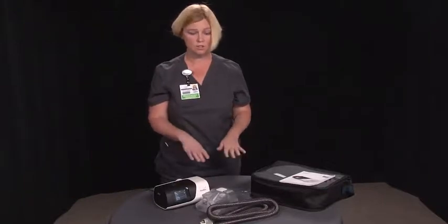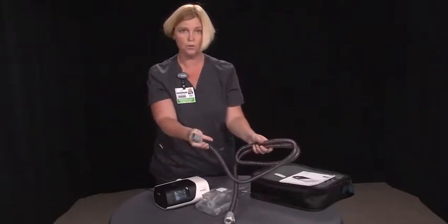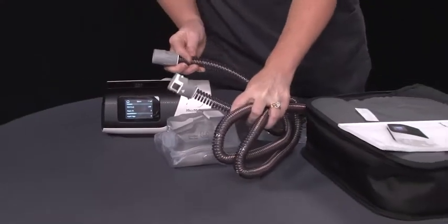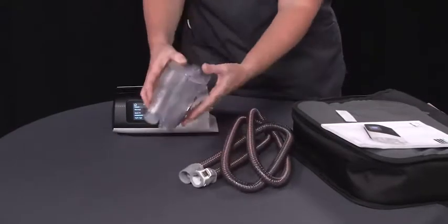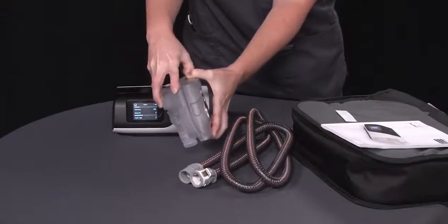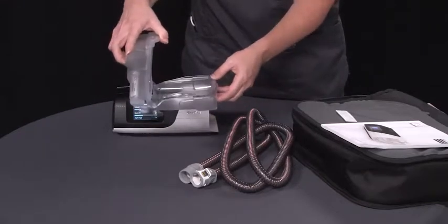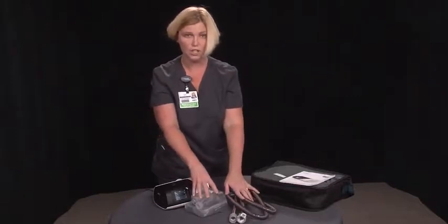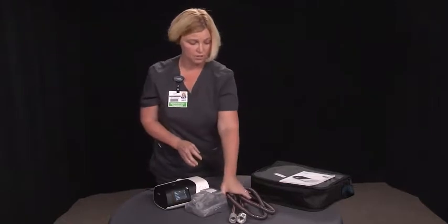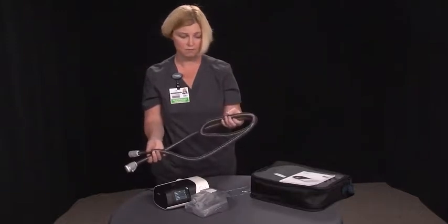Once it's good and soaked, you're going to take it out of the sink. You're going to turn on your faucet and run the water through the tubing. It is perfectly safe to get this end of your tubing wet. You will also rinse off your water chamber. And to do that, you'll want to open it up, rinse it out with cool water, and same with your mask and your headgear. Once all of those things have been rinsed off, you're going to lay your water chamber and your mask on your counter to dry. Your tubing you can hang over a towel rack or your shower head to let it drip dry.